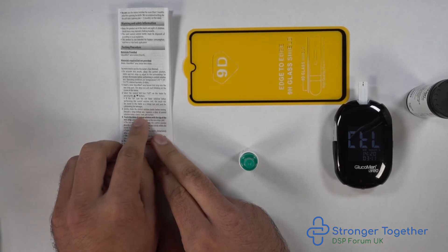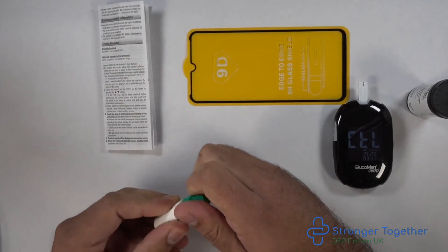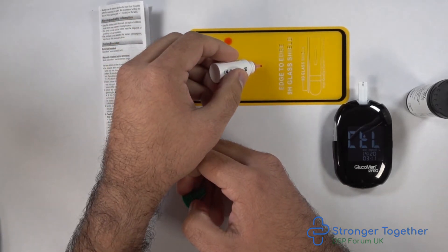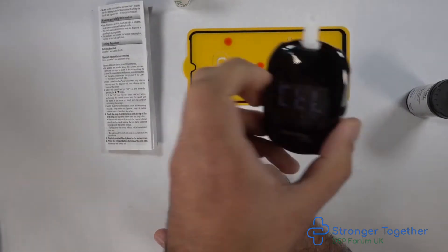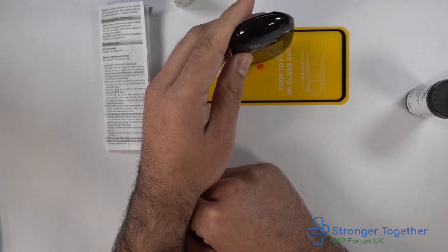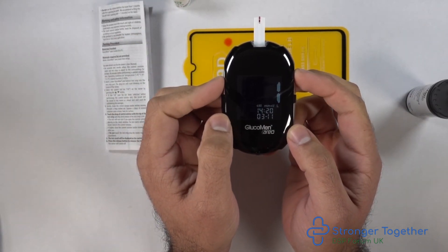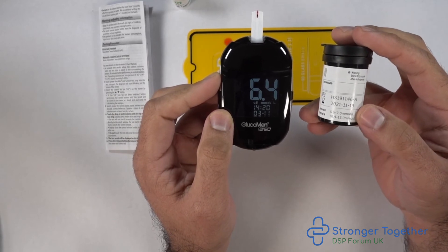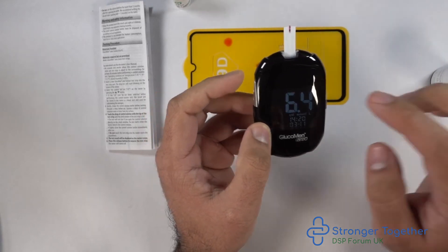We need to gently shake the control solution first. Then open the bottle and gently squeeze a drop out — I'm squeezing one drop and then a further drop, and we will use the second drop. Touch the window of the glucose test strip against the solution and the test strip should automatically take it up. The meter has a countdown from five to one. Our reading is 6.4 millimoles per liter, which is between 5.6 and 7 millimoles per liter, meaning our meter and strips are working correctly.